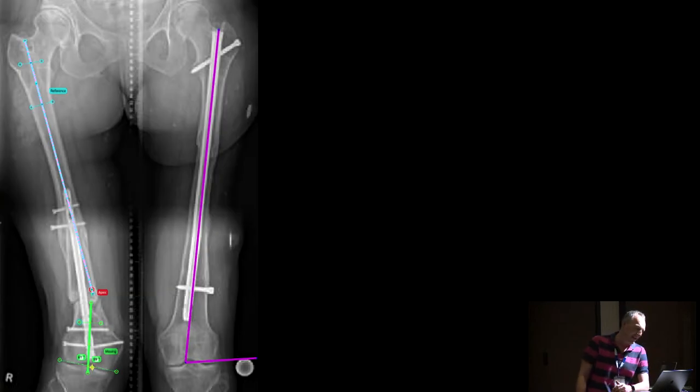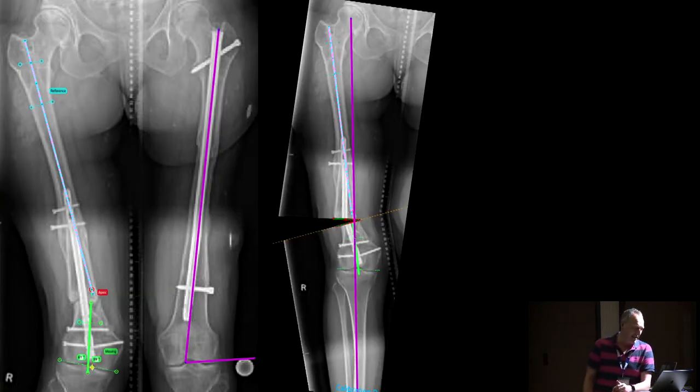So here we can see again, come back to the plan that you've already seen. And I'd like to put an intramedullary device retrograde from the knee. I'd like to put a long device in. I don't want to put a short nail in because of the problem she's already faced. But this, you can see, may well cause us a problem. So we can already see that probably partially because of the translation and partially because of that second deformity, it may be that we can't introduce the nail. So that was something we were very aware of.